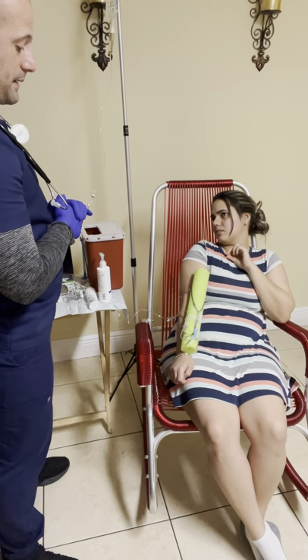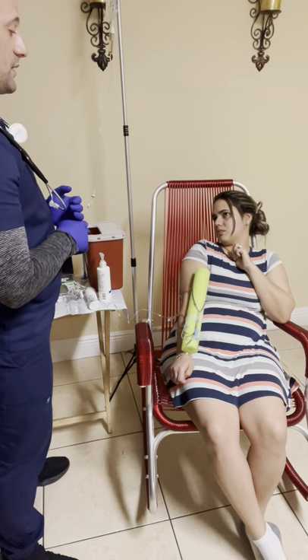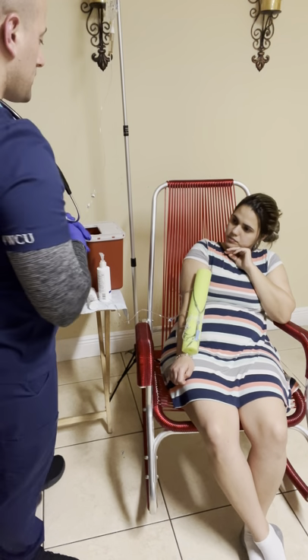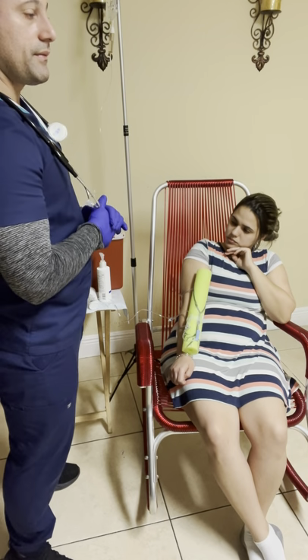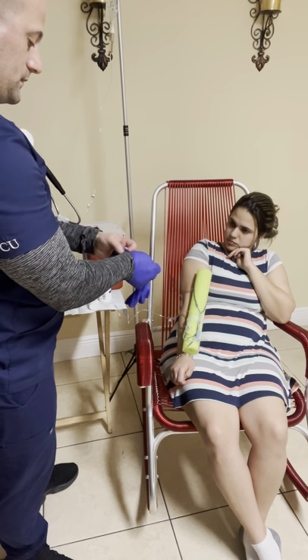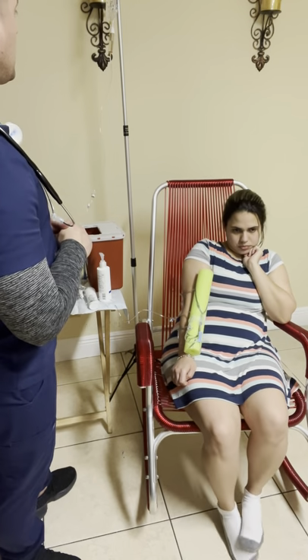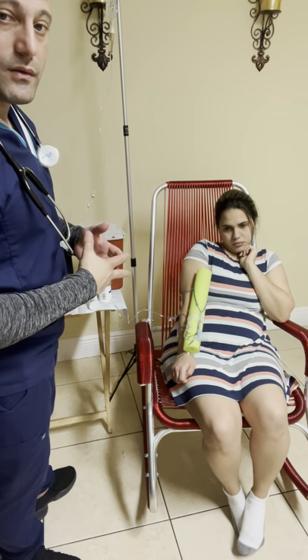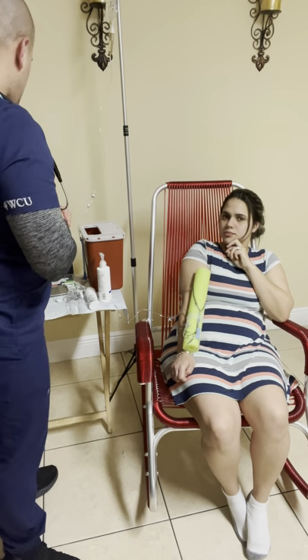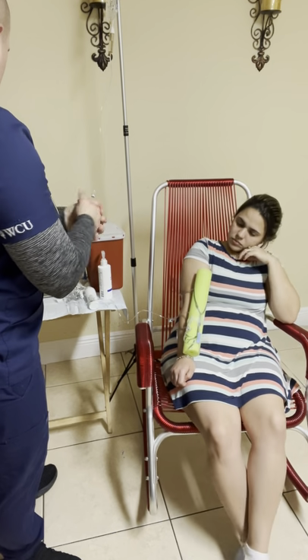Rosalia, if you feel any pain in the IV area, any burning sensation, any itching, let me know, okay? I'm going to put the patient back in a safe environment, discard the glove. Everything looks fine, the drip is according to the time that the doctor ordered. Hand hygiene. And that's it.